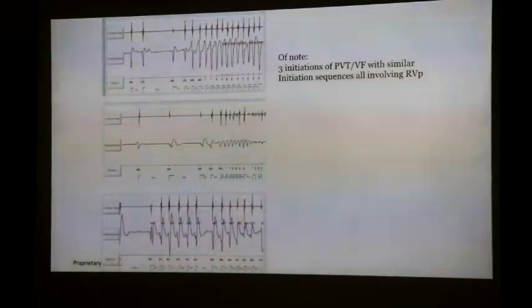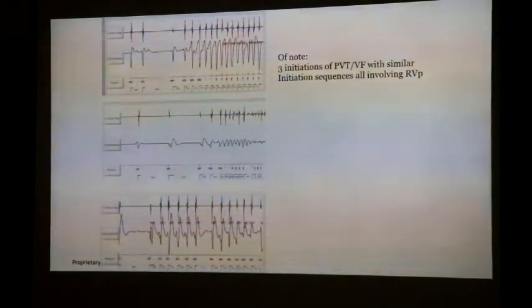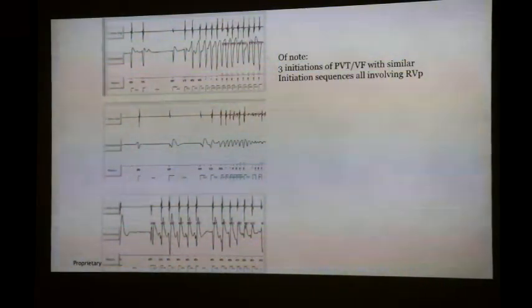Scar and heart disease, low ejection fraction, sinus rhythm with a PR interval of 170. Would you put a pacemaker into him? Would you implant a dual chamber pacemaker? No, because he hasn't got bradycardia or symptoms. So it's okay to turn the pacing off, right? You want him to be allowed to be bradycardic, but you don't want him to pace, right?